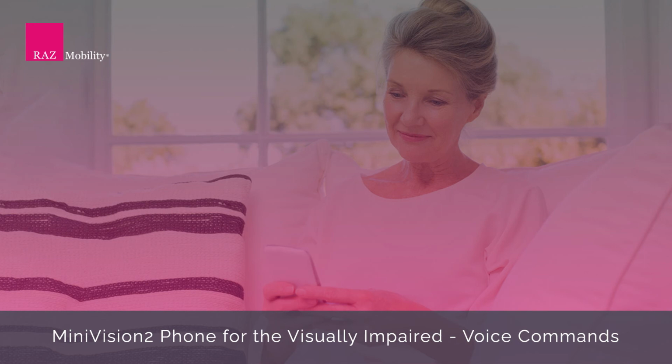Again, I'm going to press and hold the OK button until it talks to me. Once it starts talking, I'm going to release the OK button. And once it beeps, I will then start talking. Speak after the beep. Good morning, period. It's Jerry, period. How are you doing, question mark. Me, comma, I'm doing really well, period. Good morning. It's Jerry. How are you doing? Me, I'm doing really well.